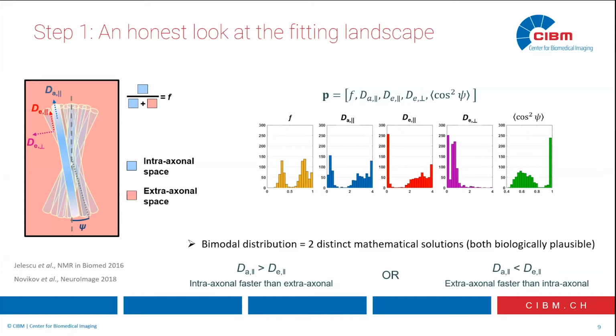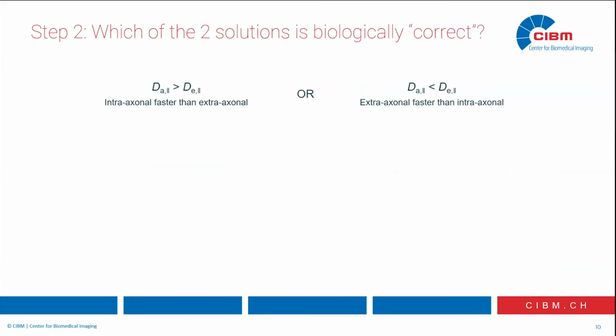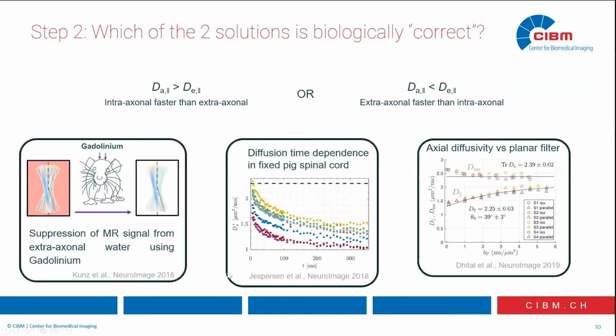And it was very interesting that in the subsequent years, many different groups actually tried to answer then this question using very different methods or approaches. And so it was a very nice moment in the community that all these papers came out roughly at the same time. And so this is work from our group here at CIBM and a group in Denmark and another group in Germany. And so everyone used a different approach. But what was really striking is that we all came to the same conclusion or answer to this question, that the intraaxonal water was faster than the extraaxonal. So this is one additional brick of understanding that we brought to the white matter model.